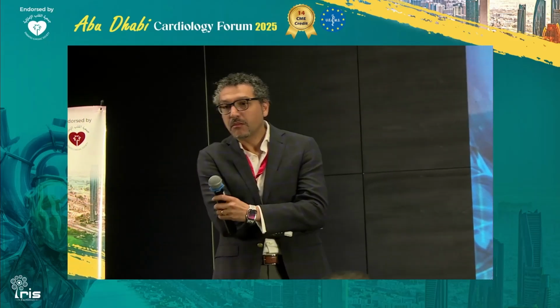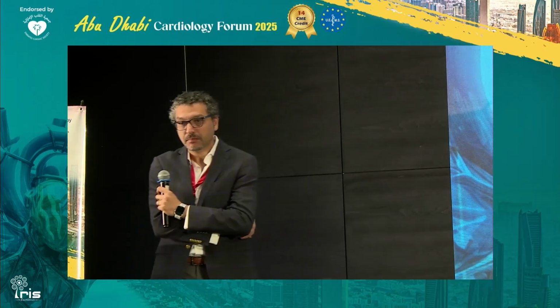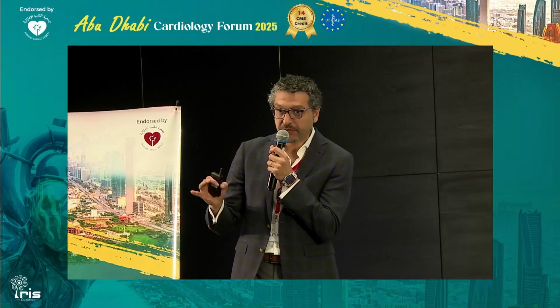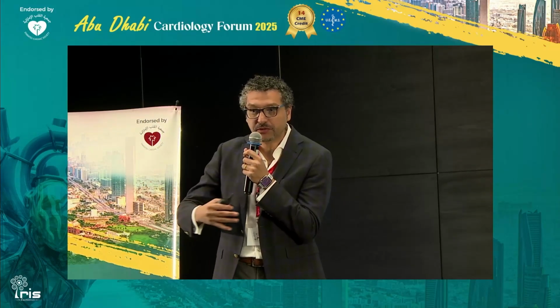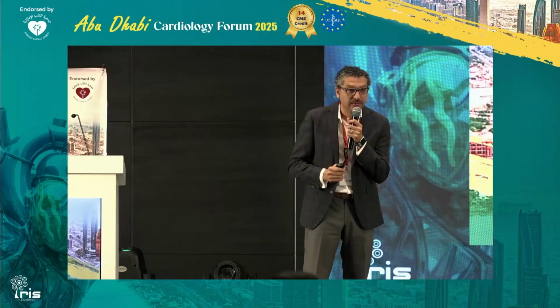So this happens 10 years after the initial surgery. We will try to look closely for the reason why it happens, for any dehiscence, abscess, any infection, anything. That's a very good question. It's important to find out what is the etiological cause for this dehiscence after 10 years. If there is no reason, if there is no abscess, if there is no infection, probably I will go for the occluder. We did blood cultures. We did a thorough history through the previous years, and we just went through the history of the patient. He didn't have any signs or symptoms of infective endocarditis, which was a bit weird.